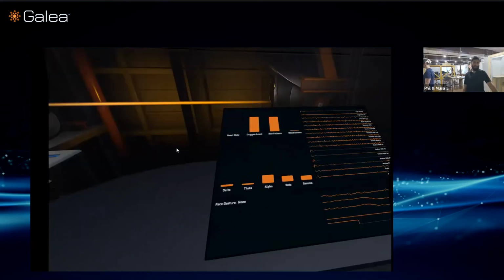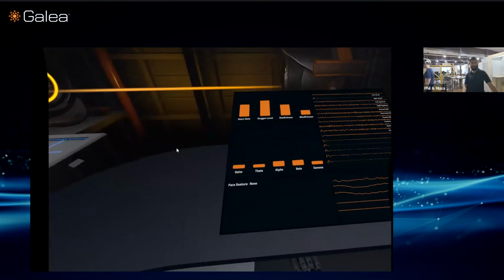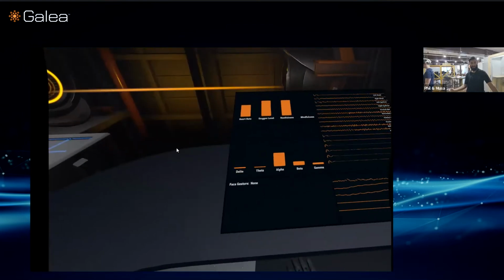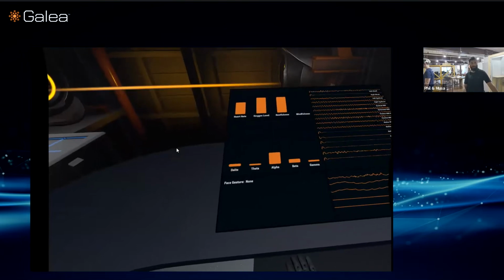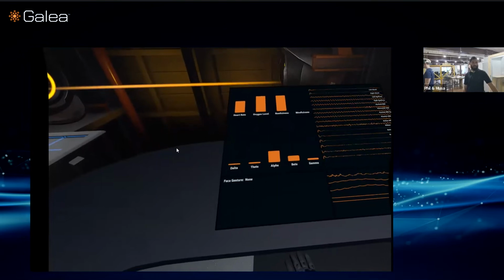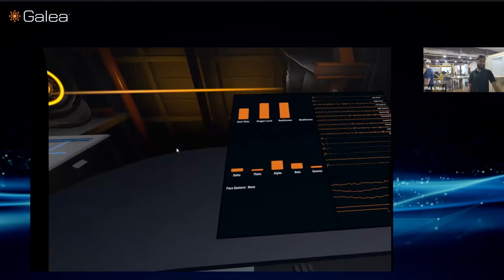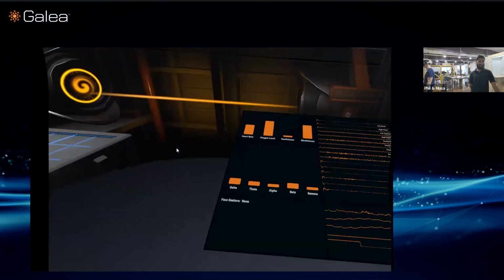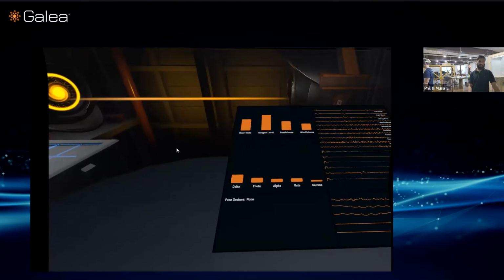One that you might be familiar with is alpha rhythms. Alpha rhythms are generated when your mind is relaxed, typically when your eyes are closed. Like Phil can demonstrate now, with his eyes closed. That creates a dominant frequency component in the 8 to 12 hertz range. The other ranges can be useful in other applications. In sleep studies, you'll see a lot of very low frequency signals in the 2 to 4 hertz range, and that's encompassed in the delta band.